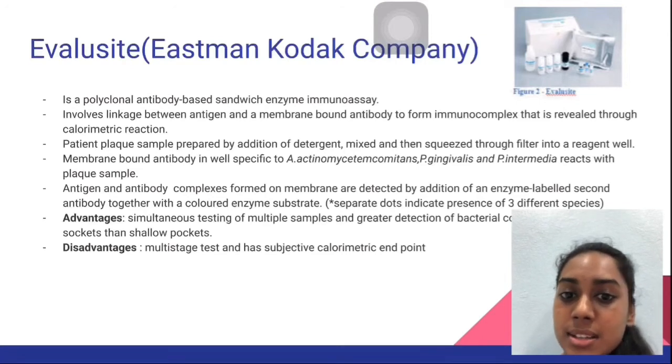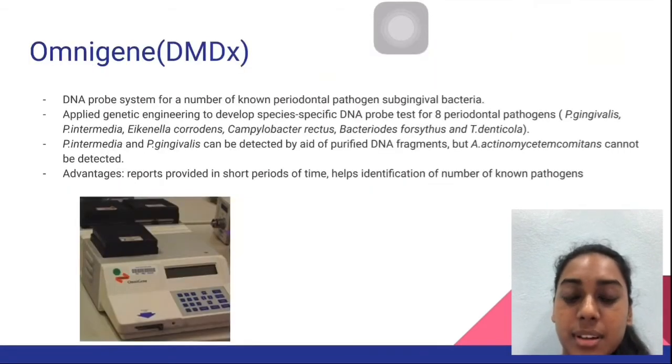The advantages of this test: it can carry out simultaneous testing of multiple samples, and has greater detection of bacterial colonization in deep pockets than shallow pockets. The disadvantages of this test are that it is a multi-stage test and has a subjective colorimetric endpoint.